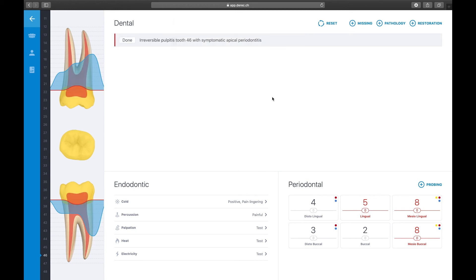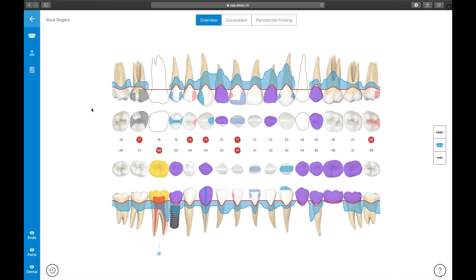When you agree with the suggested diagnosis, Derek will mark the pulp as a to-do — the pulp turns red. In the chart view, you will see the test results through the changing endo icons. A snowflake tells you that the tooth is painful on cold, and the percussion symbol tells you that the tooth is painful to percussion. The next step would be to perform a pulpotomy or a root canal treatment.